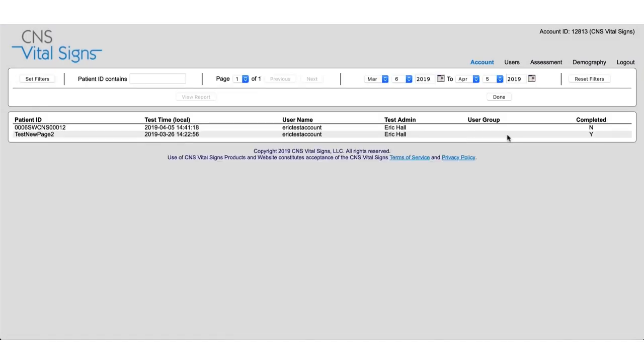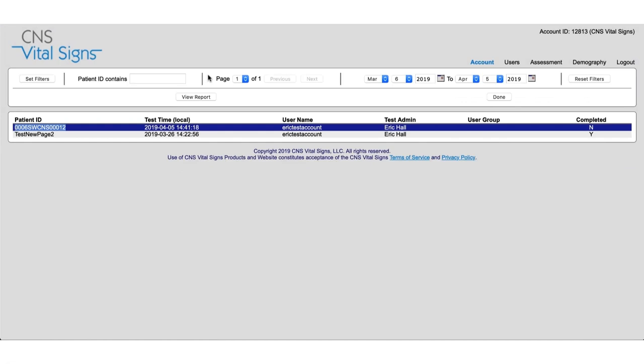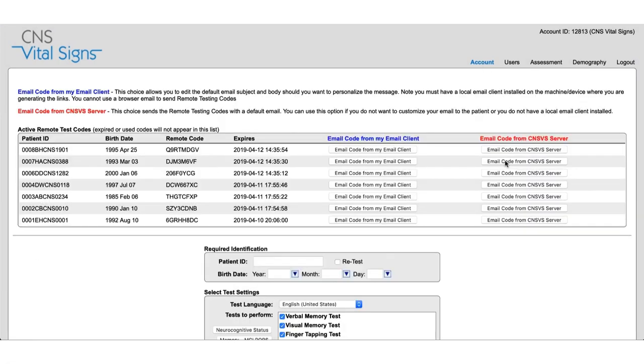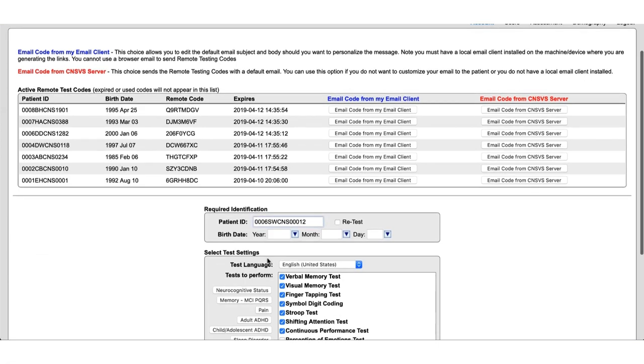The results will be accessible through the view reports button here and you can see that this because I chose not to complete the test we have a non-completed designation here and if this does happen and your patient does need a new test all you have to do is go back to the CNSVS remote testing area you will see that test code is no longer available and if we need to create a new test we can do so.